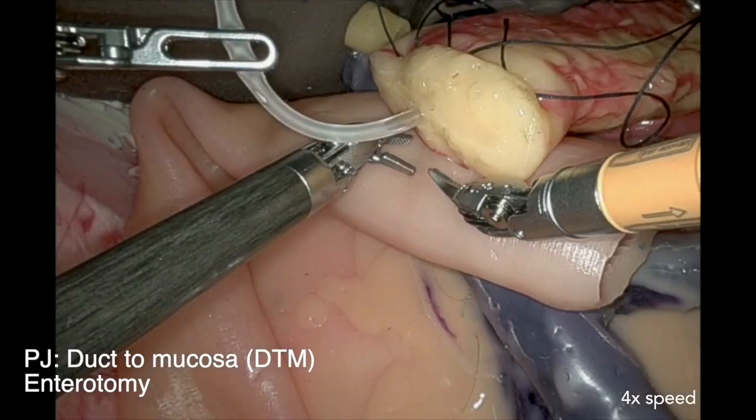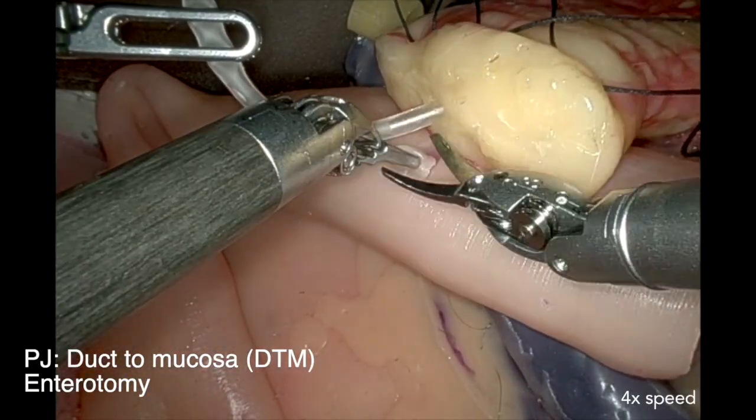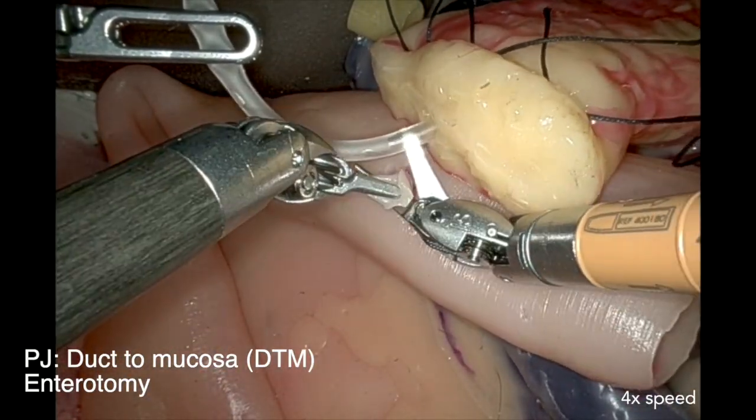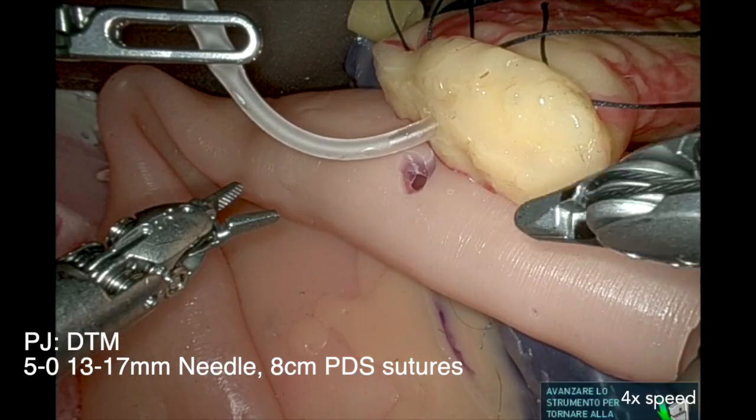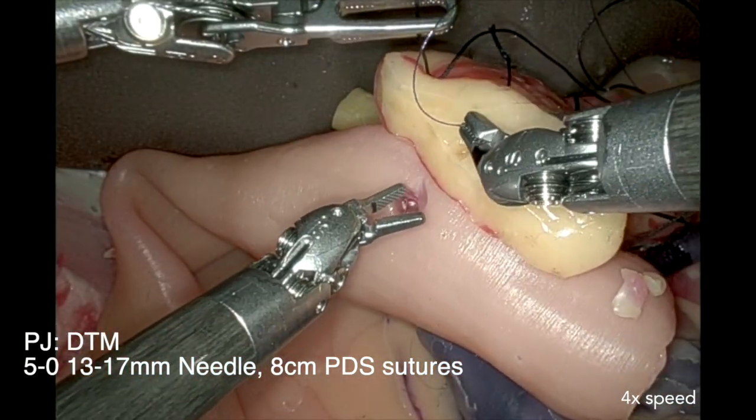Now we move to the duct-to-mucosa phase, where we first make an enterotomy that corresponds with the size of the pancreatic duct. Make sure to be inside the lumen, optimize your exposure, and then start with duct-to-mucosa suturing.